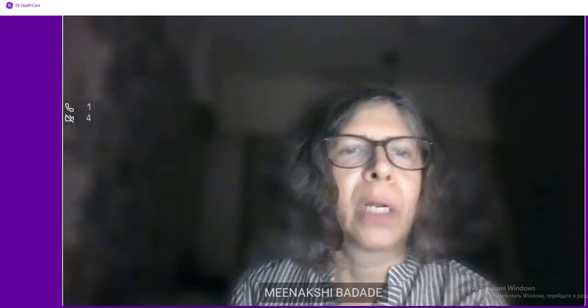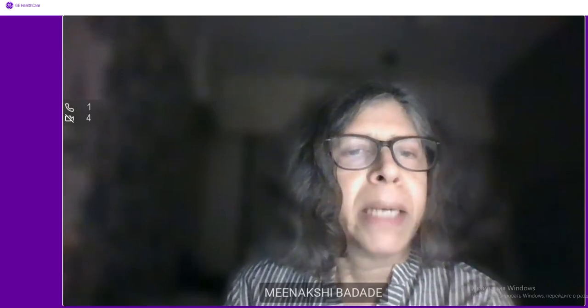So we come to the last slide, and so the take-home message would be that MSK ultrasound has a steep learning curve. You require good quality equipment. Today we worked on the Versana Premier machine. It requires technical skill, which Bill has amply demonstrated. We need a knowledge of range of normal appearances over different age groups so that we do not overcall abnormality. Dynamic maneuvers require use of both hands and need a lot of practice.